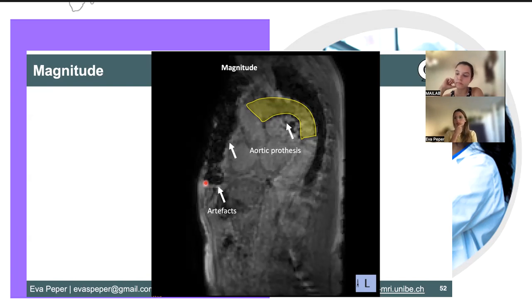You can also apply it to veins or even, I think, cerebral fluid flow, which people have applied it to. You can also apply 4D flow not only to encode the velocity of the moving blood, but also for other motion. A colleague of mine did this, for example, if you move your leg, like the motion of your muscles or whatever. So it just encodes motion in the first place. So you can also use it to encode any other type of motion that you're interested in.